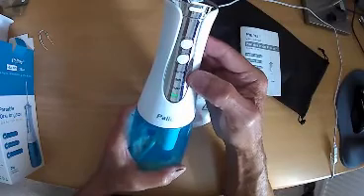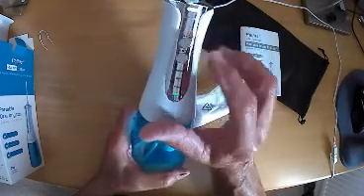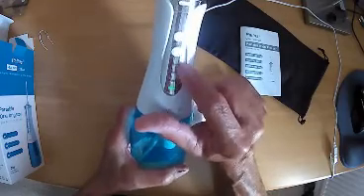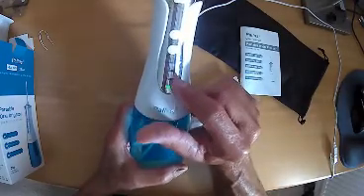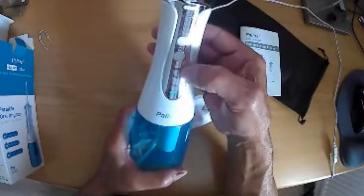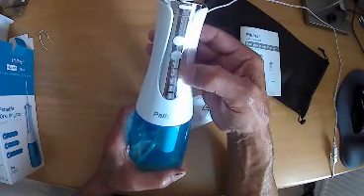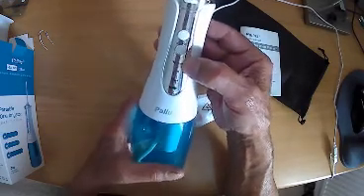It's got three modes of operation with an on/off switch, and then a mode button that selects either normal, soft, or pulsed. By simply pressing the on/off button once it steps through the different modes of operation.